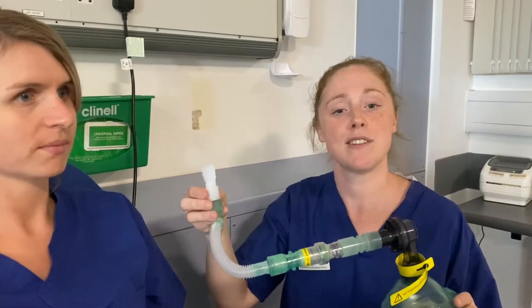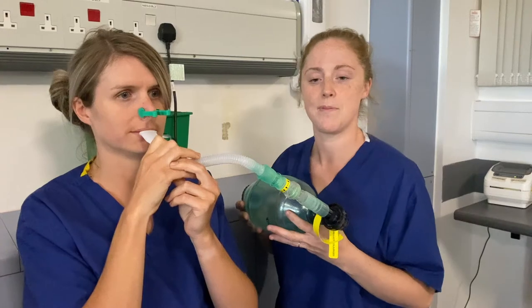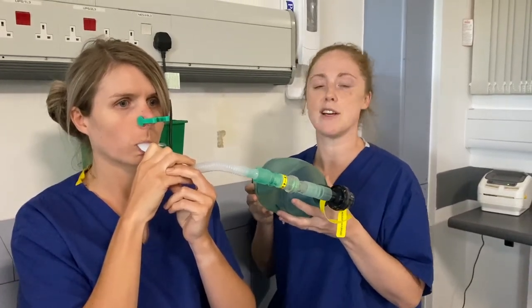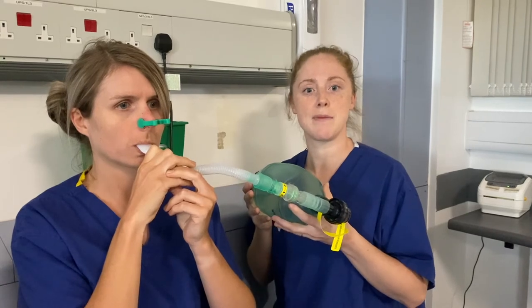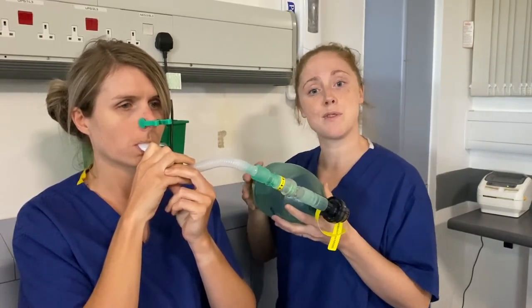I'm now going to demonstrate the LVRB using a mouthpiece and a nose clip. You'll be asked to place the nose clip on your nose, or your carer can do this for you if required. You'll then be asked to place the mouthpiece into your mouth and form a tight seal — sometimes biting on the mouthpiece to create this seal can help. The technique will then be the same as it was for the face mask.